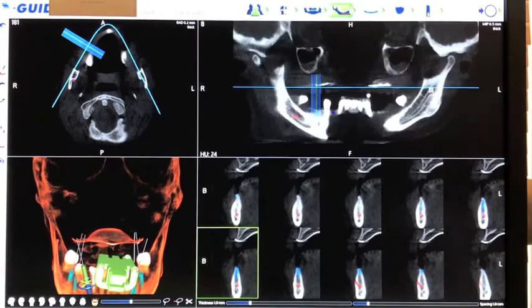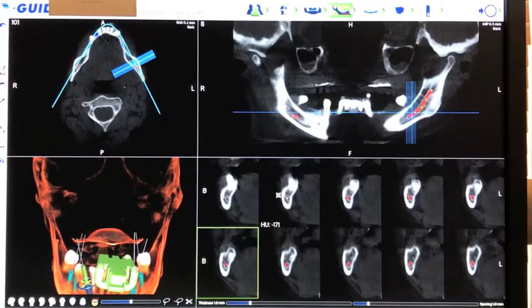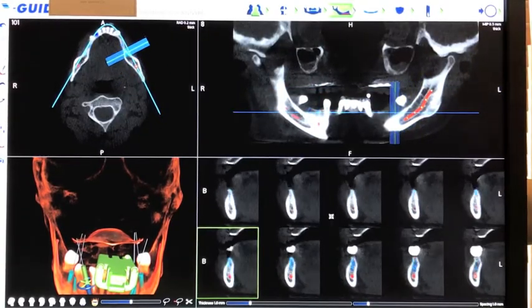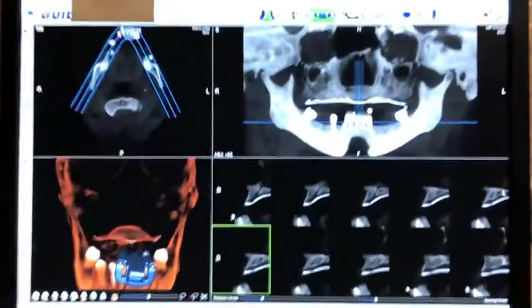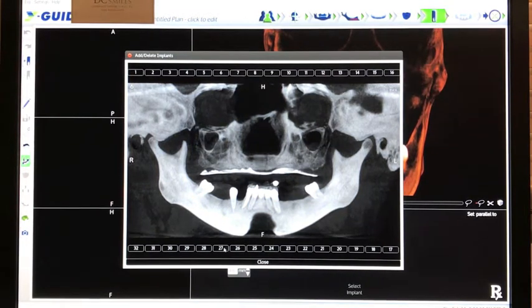This scan is now used to precisely plan implant locations. The first step in planning for this case is to trace the patient's nerve to verify that the planned placement will not affect the nerve.